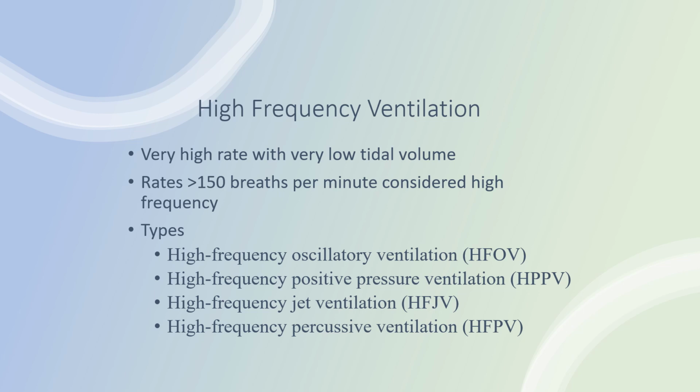Those being high-frequency oscillatory ventilation, high-frequency positive pressure ventilation, high-frequency jet ventilation, and high-frequency percussive ventilation. While each mode is providing high respiratory rates, each mode exploits different details to accomplish this goal. Each of the differences provide unique benefits and creates other complications. This lecture will focus on high-frequency jet ventilation.